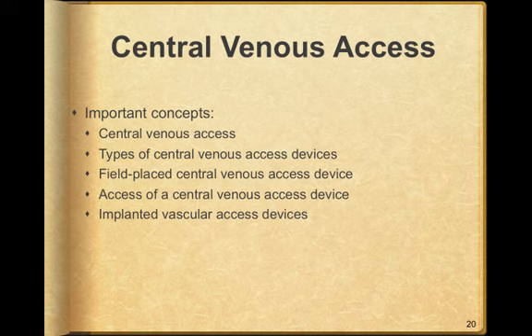Access of central venous access device, how we would actually access the device itself. Very simply clean off the area if we need to administer medication to it off of, like, say, a triple lumen or a femoral vein. And then implanted devices. Implanted devices are for long-term venous access, and they require special needles. So be sure you have the appropriate needle when accessing a site. Current protocols generally require us to call online medical control to access such devices.